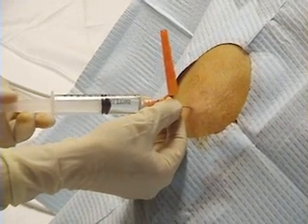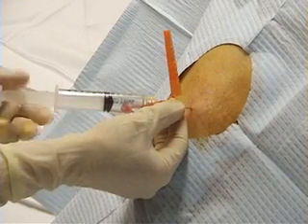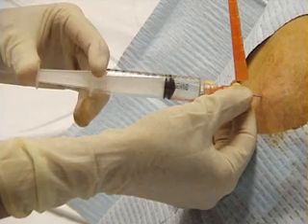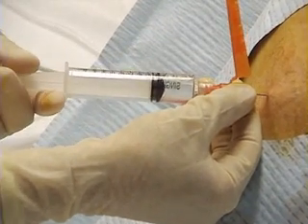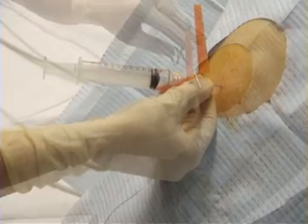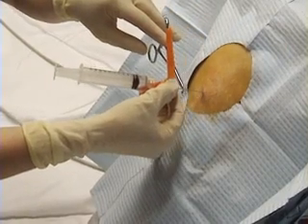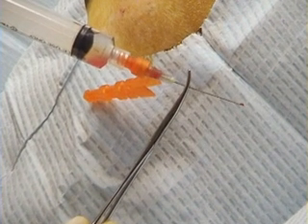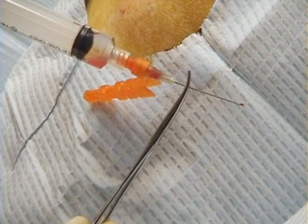Once the needle enters the pleural space, pleural fluid will begin to fill the syringe. Inject more anesthetic at this point to anesthetize the highly sensitive parietal pleura. Note the depth of penetration and then withdraw the needle. If available, a hemostat may be attached to the exposed portion of the needle to mark the depth of the pleural space.